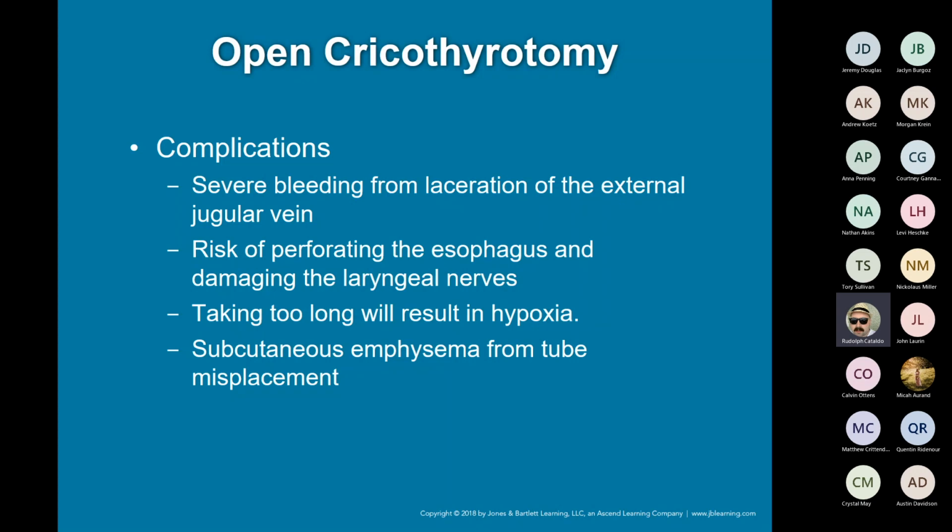Somebody had asked me, a couple years ago, in one of the CCP programs, if I push the needle too far, is there a potential I can go back through the back of the trachea? That was a valid question. I honestly didn't know the answer to it. I consulted with our medical director, Dr. Poole in the ER at Mercy. He said the back of the trachea is actually super tough, almost like bone. He said it would be almost impossible for you to penetrate through the back of it.